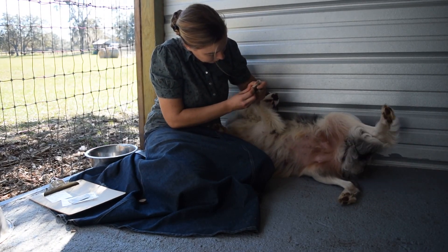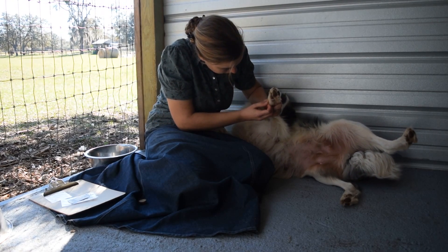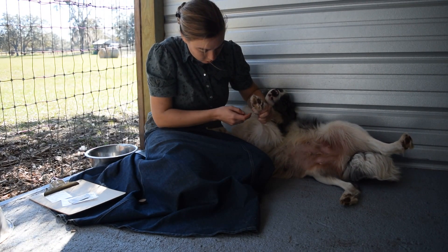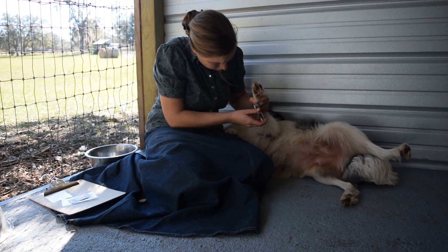On a dog with light colored toenails, you can see exactly where the blood vessel comes and clip accordingly. I like to take it from the dewclaw because the dewclaw will tend to curl around and go into their paw. So if I'm going to cut one particularly short, I'm going to make it a dewclaw.